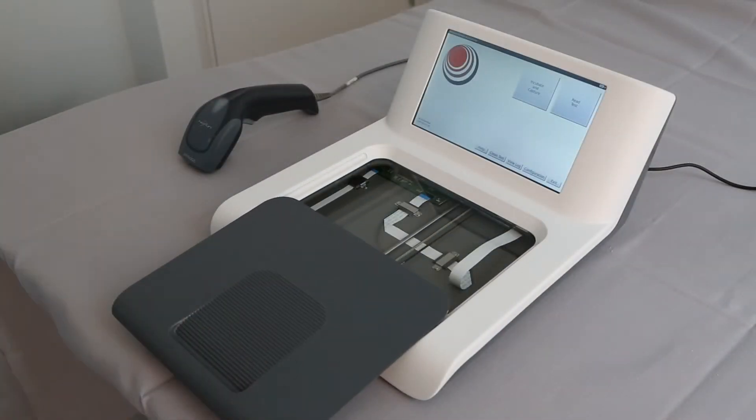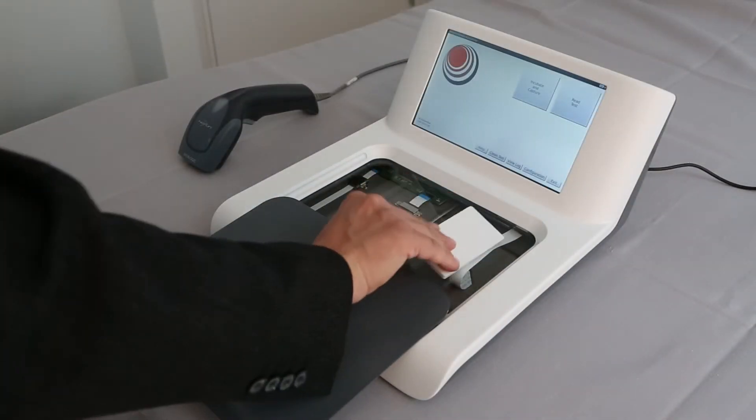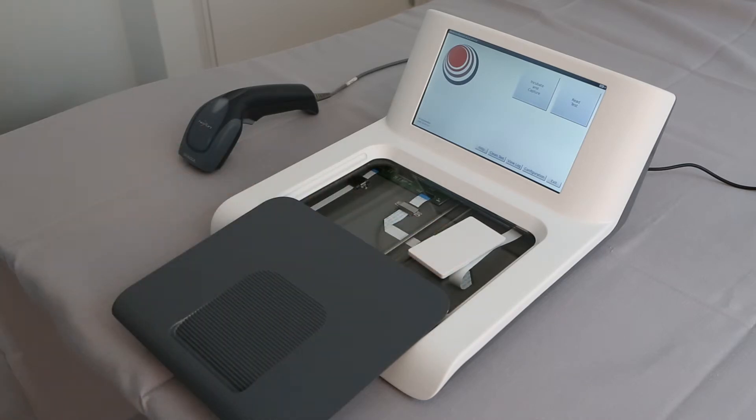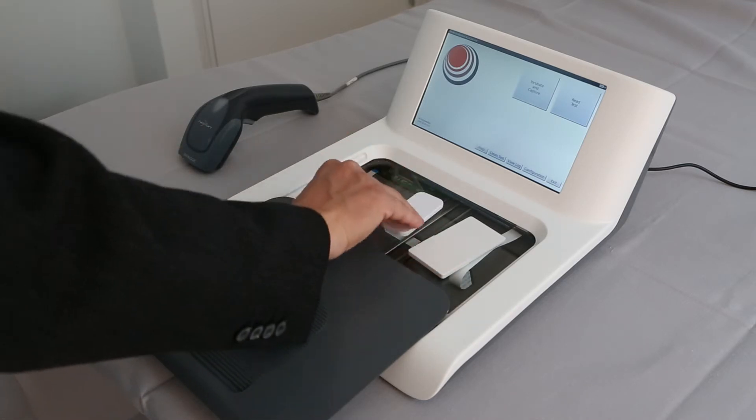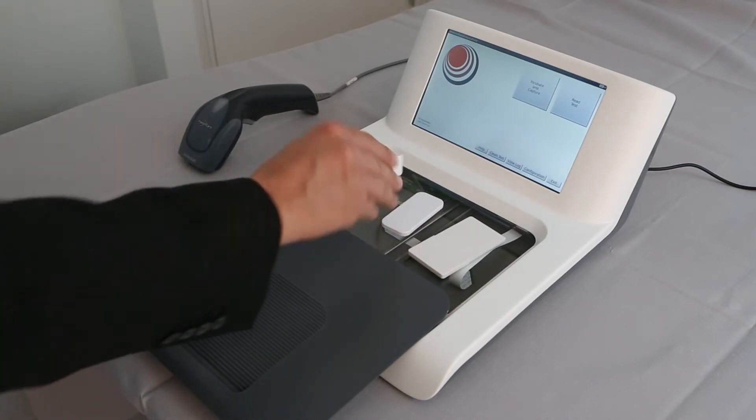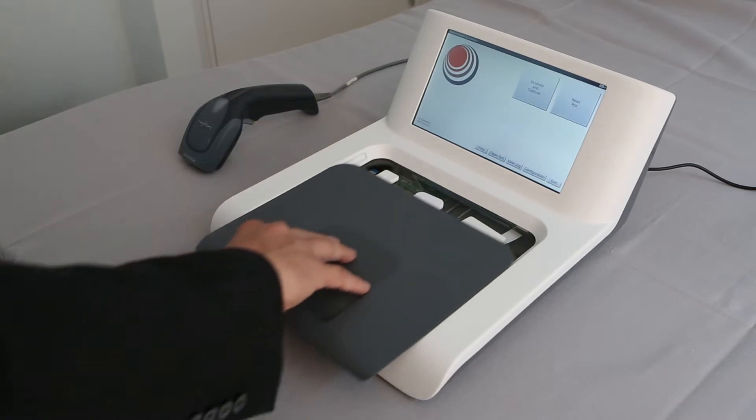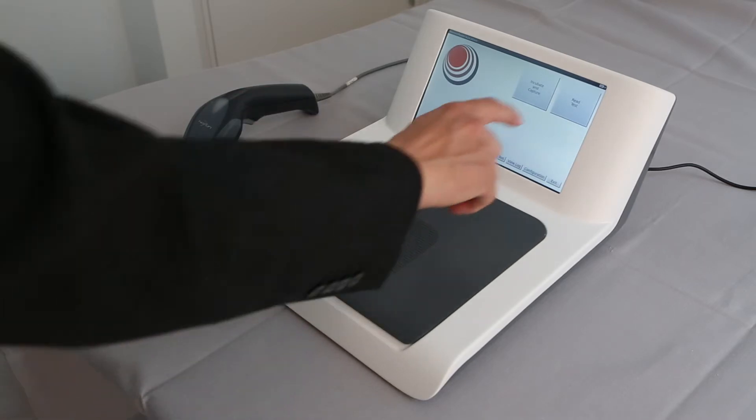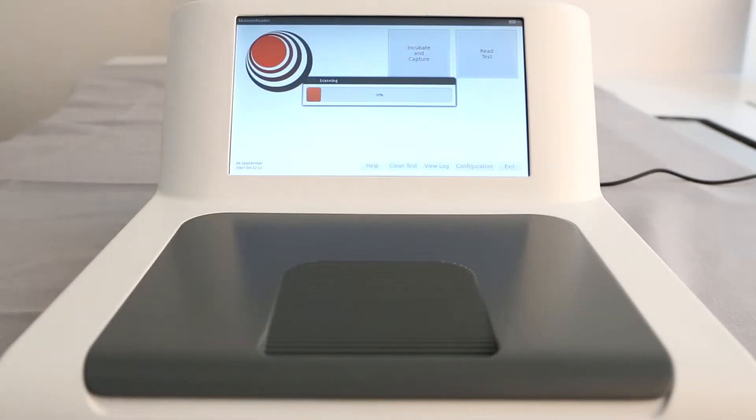The job has never been easier. First, place one or more cassettes on the scanner plate. Close the lid and tap Read Sample. The result appears in only a few seconds.